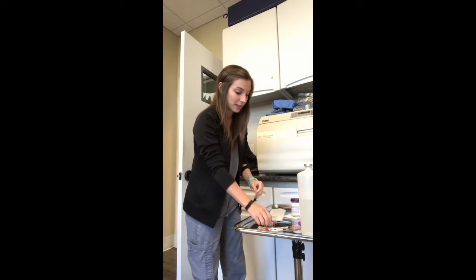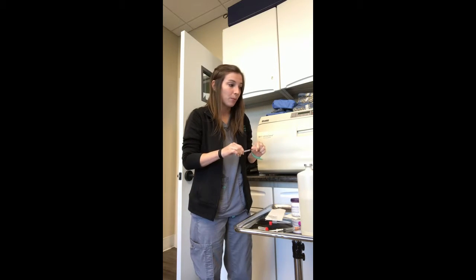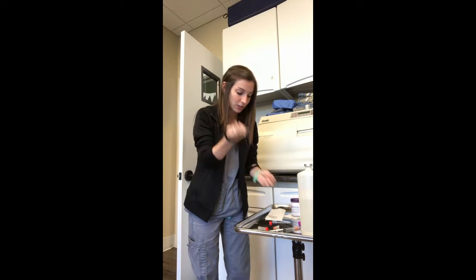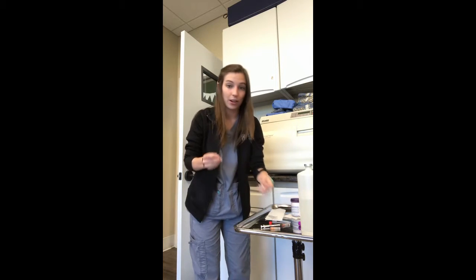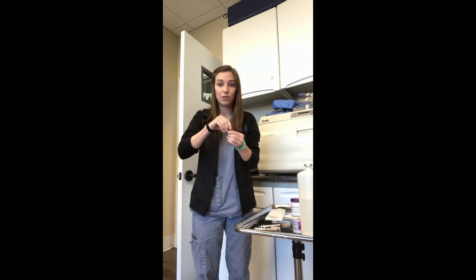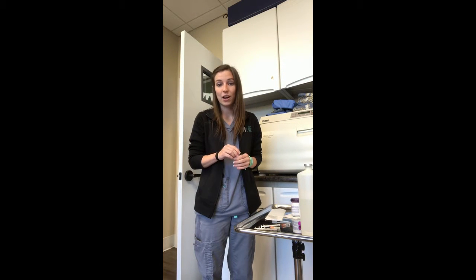I will be performing a modified Knott's heartworm test. I will do this by mixing a 1 to 9 ratio of anticoagulated blood with saline — 0.1 mL of uncoagulated blood and 0.9 mL of sterile saline. I am mixing it into a centrifuge tube, which I will centrifuge for 5 minutes at 1,000 to 1,500 RPMs.